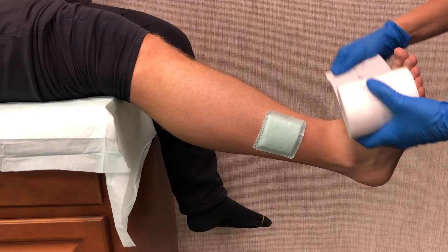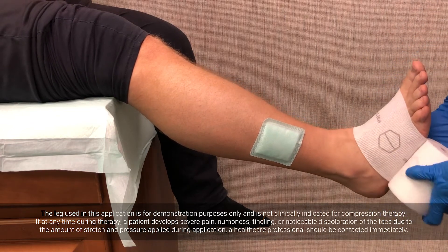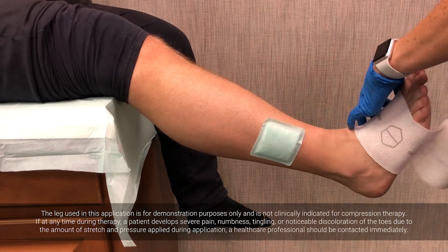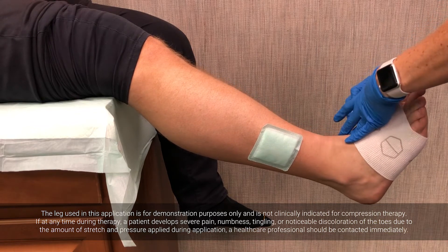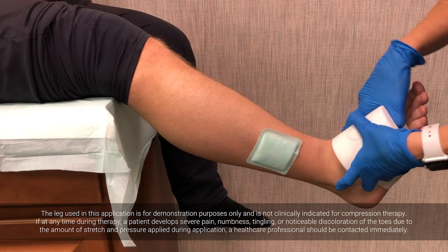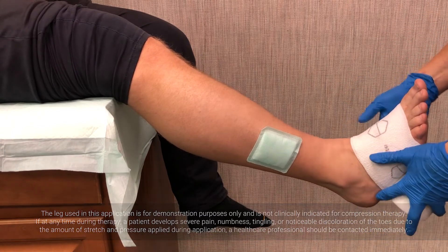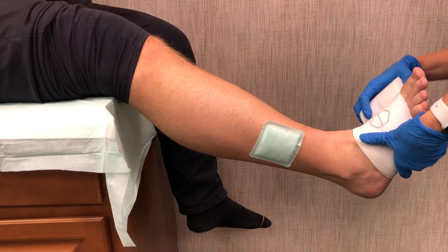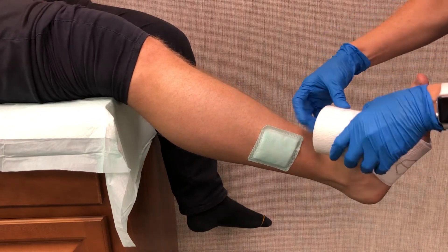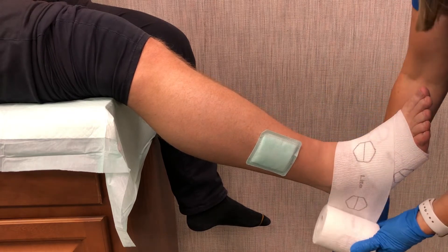When applying 2Press 2 Lite, make sure that the patient's foot is at a 90-degree angle to the lower leg. Layer 1 is the white padding bandage with short-stretch properties. It is made of an air-permeable non-woven for high patient comfort, and it has a cohesive coating on one side to tie into the second layer to reduce slippage. The white padding bandage needs to be applied with the soft, uncoated side against the skin and the indicator visible. Start next to the base of the toes, ignoring the indicator at first.